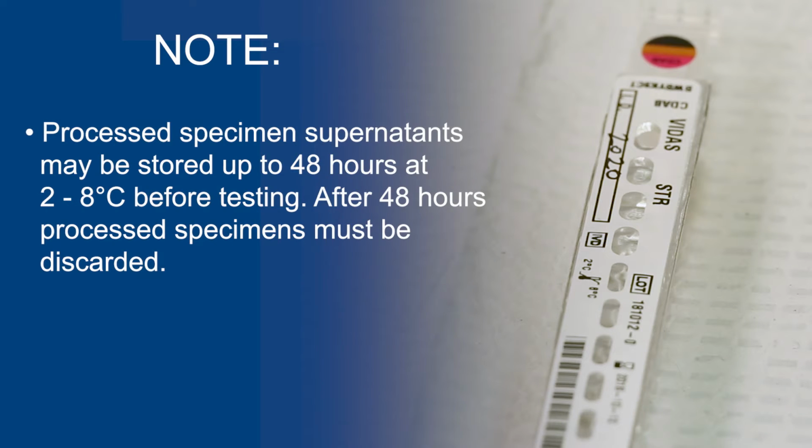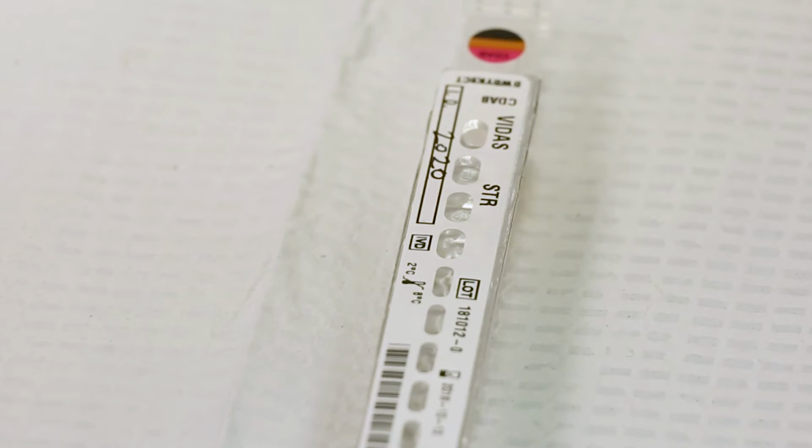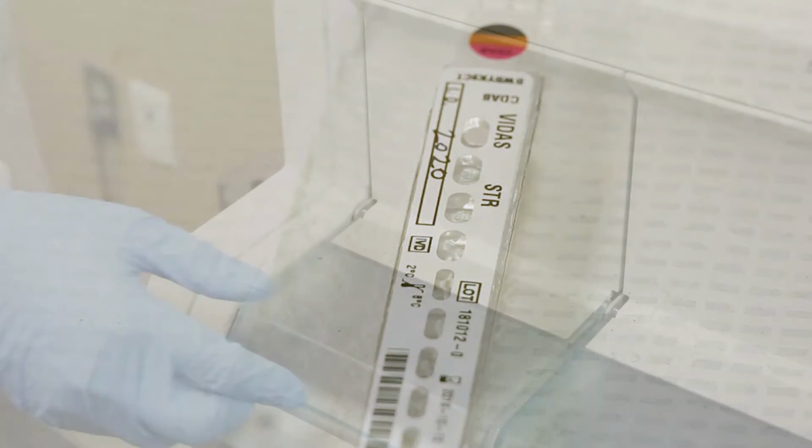Note, processed specimen supernatant may be stored up to 48 hours at 2 to 8 degrees Celsius before testing. After 48 hours, processed specimens must be discarded. Once the strip has been inoculated, proceed to load onto the VIDAS instrument.